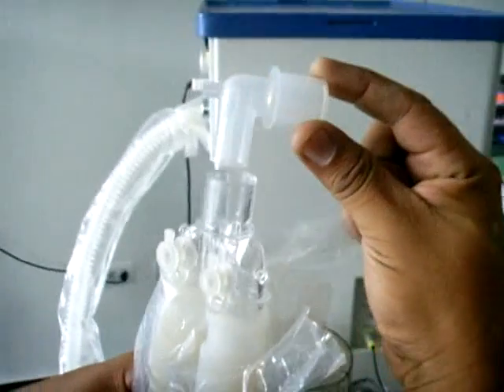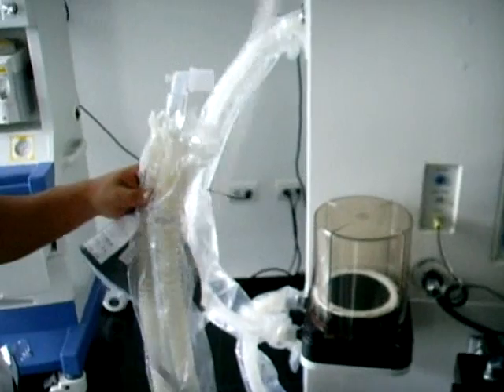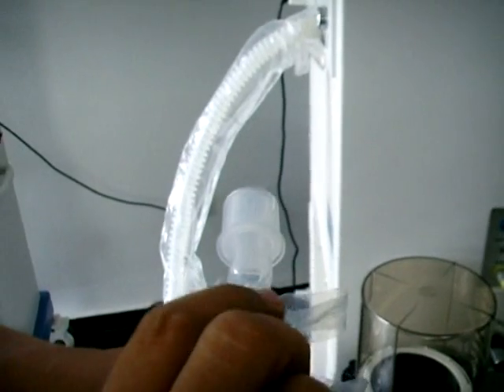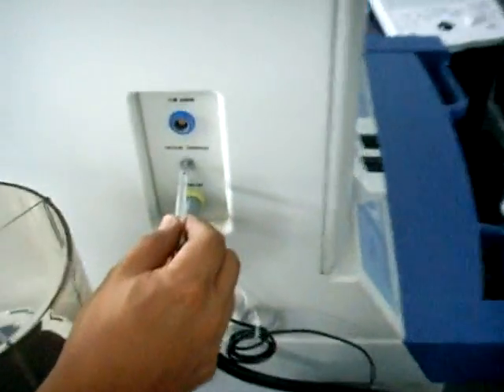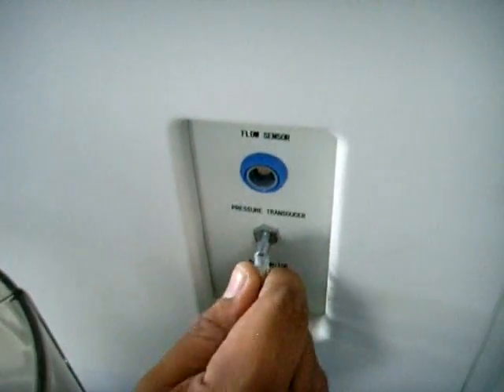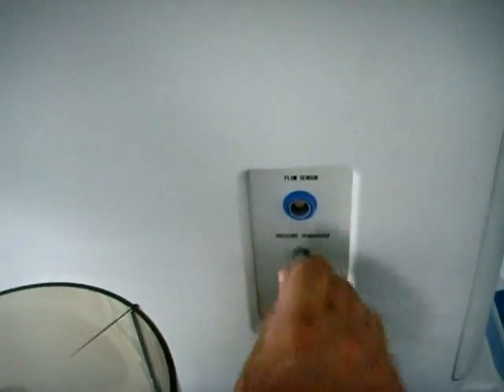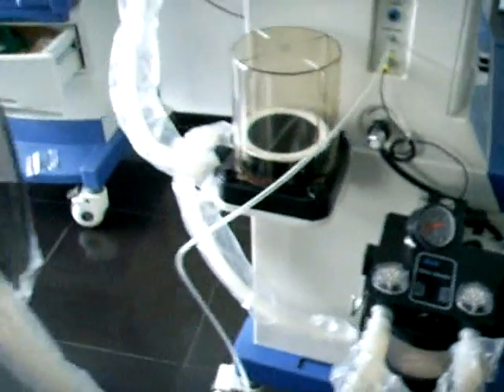Seguidamente conectamos el acople en L junto con el acople en Y, asegurándonos que queden completamente conectados. Realizamos la instalación de la manguera del circuito del paciente conectándola en el extremo restante del acople en L. La otra terminal de la manguera es conectada en la parte lateral izquierda de la máquina, donde se encuentran los conectores, en la terminal nombrada Pressure Transducer. Debemos asegurarnos que este quede completamente introducido, ya que este será quien mida la presión en la vía aérea.